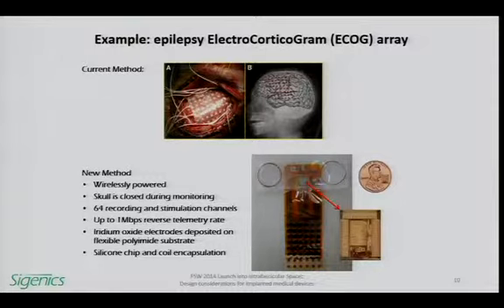Yeah, I see the chip sitting on a penny. Okay, now I see that. But the part on the left there is not relative to the size of the penny. Yeah, so the penny is roughly the same size scale as this entire object. The IC chip is a little silver rectangle up there. Okay, thanks.